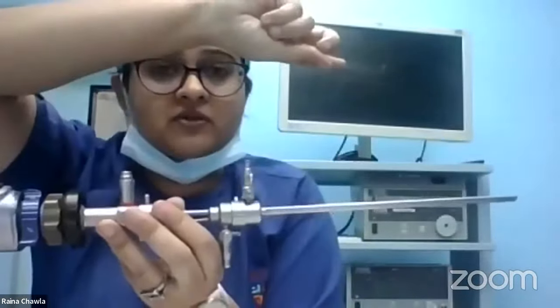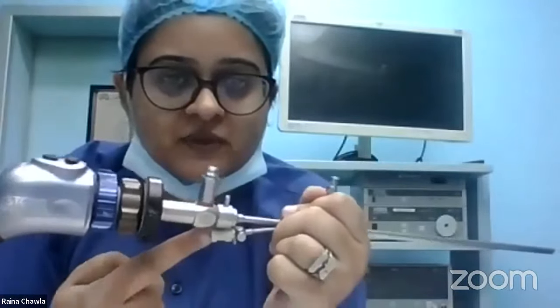And again, we'll be able to see on the image. Suppose there's a polyp, I introduce an instrument here, a very thin instrument is introduced here, which will come out from here, say a scissors, where I can do a polypectomy. Or say she has a missing intrauterine device.